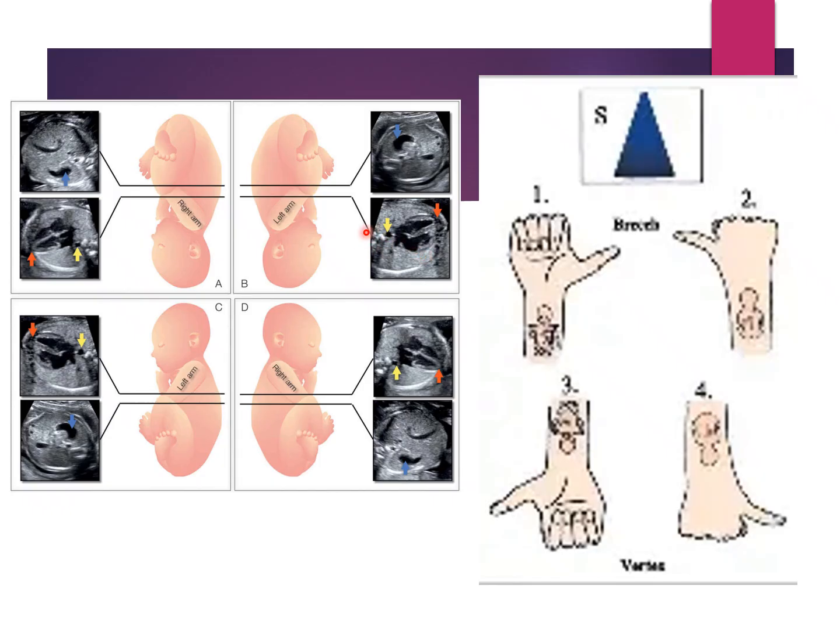We're going to find that spine, we're going to see the aorta, we're going to see the heart, apex of the heart pointing to the left, which means that baby's left side is closer to our camera and right side is more posterior. So this baby is head down, maternal left.